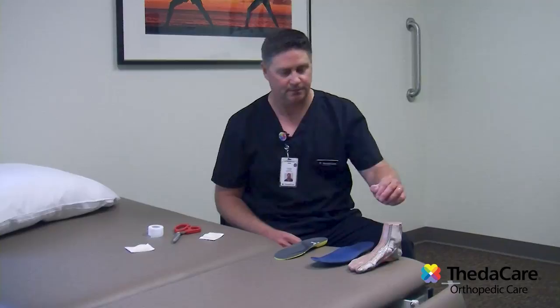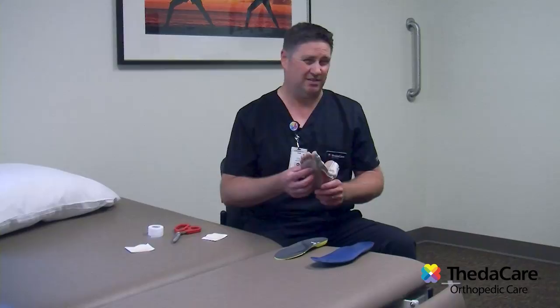Hi, I'm Greg. I'm one of the licensed athletic trainers and M.A.s from ThedaCare Orthopedic Care, and I'm going to show you how to properly place a metatarsal pad in your shoe. The purpose of the metatarsal pad is to give you relief for some common conditions in your toes and your foot, and your doctor has prescribed it for you to use.